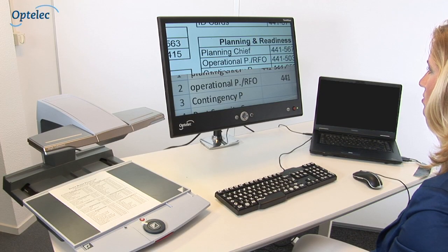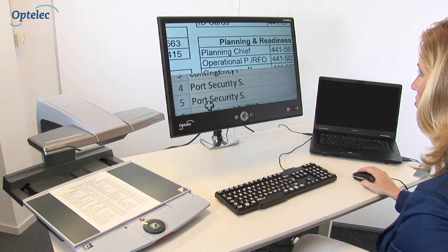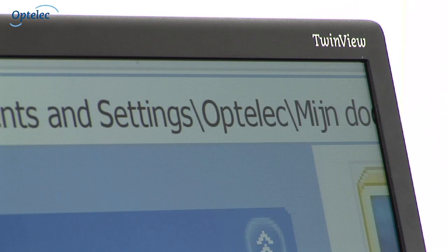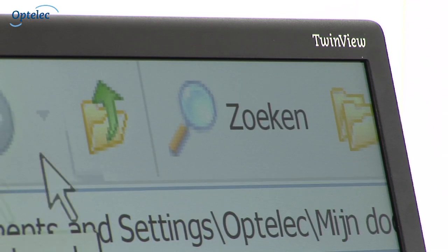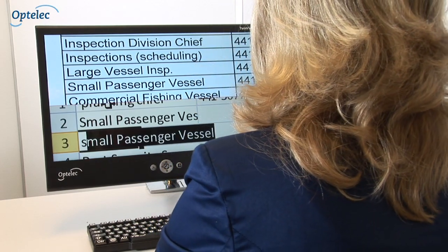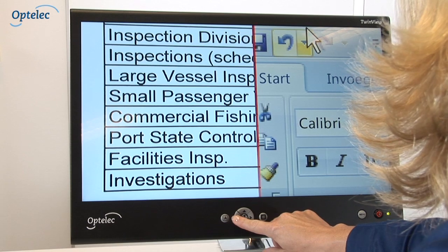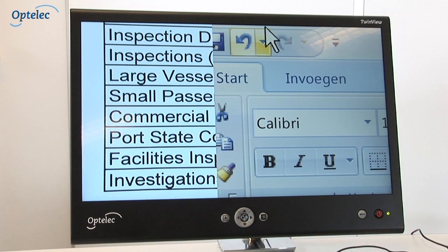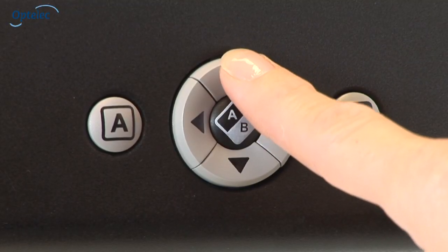The Optelec TwinView features an LED high resolution screen ensuring a noticeably sharp image in HD quality, regardless of the resolution of the computer or video magnifier. You can easily adjust the horizontal and vertical split screen using the arrow keys. The arrow keys also make it easy to modify the split position of the video magnifier displayed on screen.